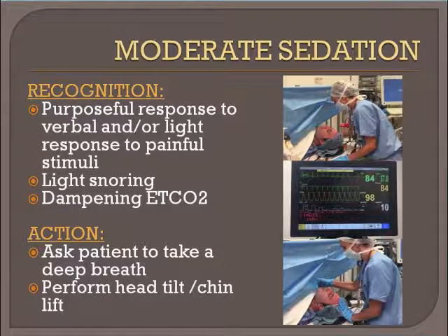When patient's level of sedation is moderate, it is important to recognize the patient's purposeful response to verbal and or light response to painful stimuli, light snoring, and dampening of end-tidal CO2. The appropriate action when the patient is moderately sedated is to ask the patient to take a deep breath and perform head tilt and chin lift.